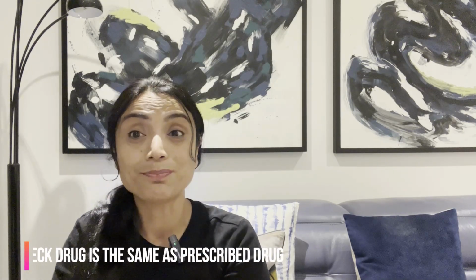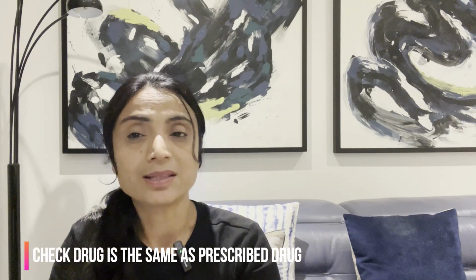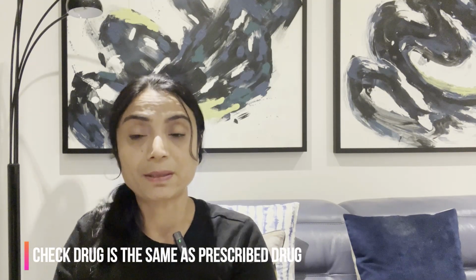Before you give it, attach it to your spacer. Make sure you do all the drug checks. So you need to check the name of the drug, the expiry, and the dose. You also need to check that your drug is the same drug as your prescribed drug. So you need to match it to your prescription very, very clearly, showing your examiner, this is the drug I am giving, examiner, and I am checking this against my prescription.